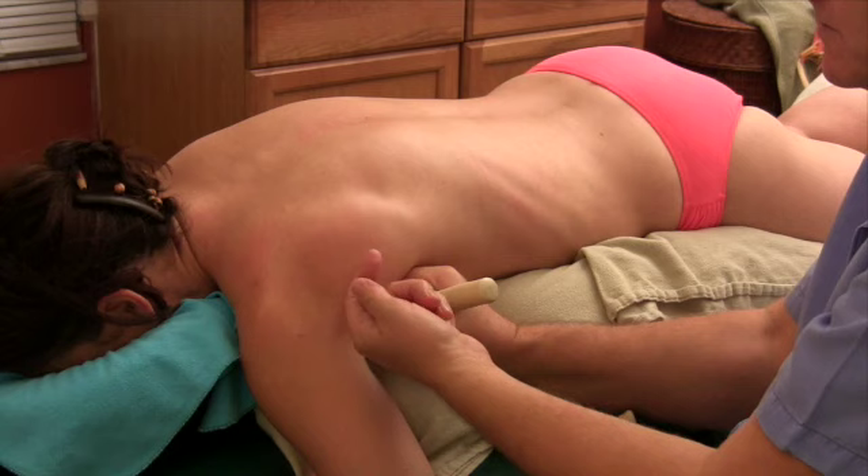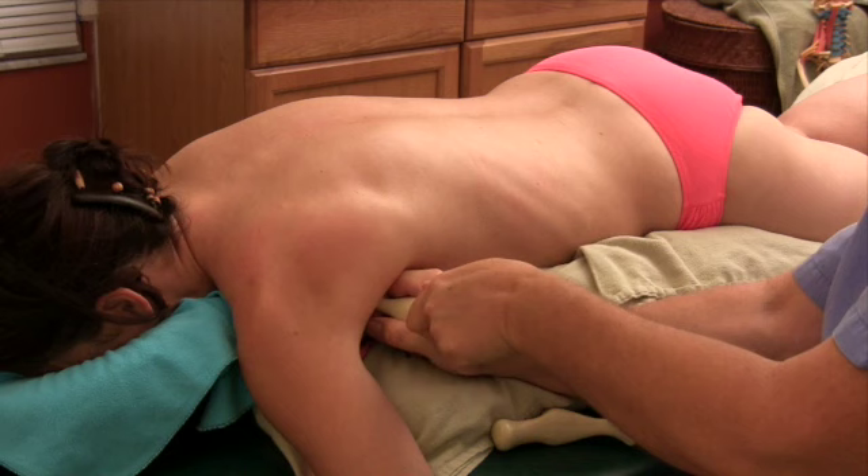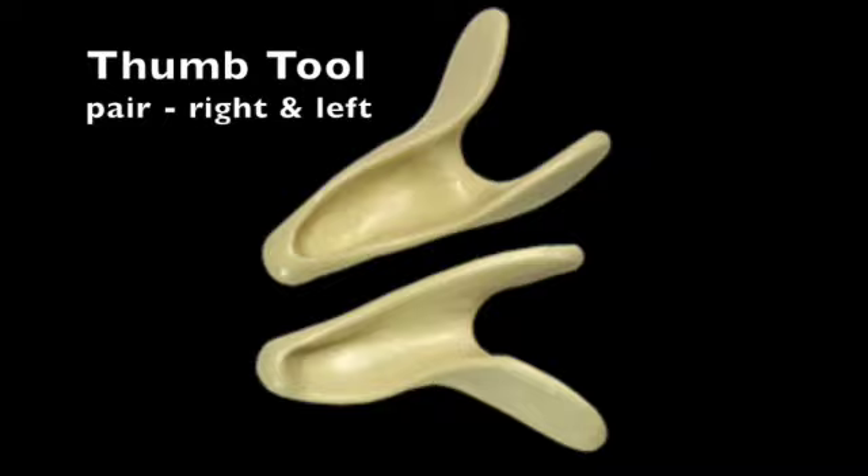So it is my intention to reach up inside here and then push posterior — in other words, directly towards the ceiling in this case — directly into that subscapularis. I've put a long handle on this tool so that I can actually use it as a bit of a fulcrum: push down on the handle and that will apply more pressure into the subscapularis if the person needs it.